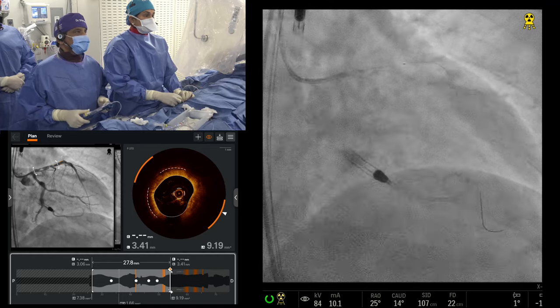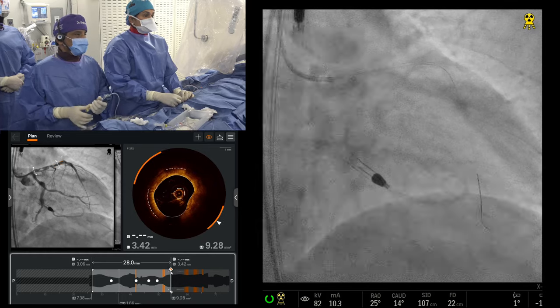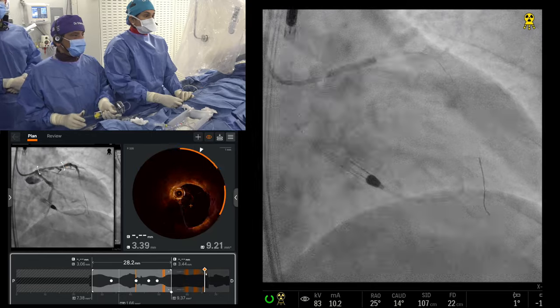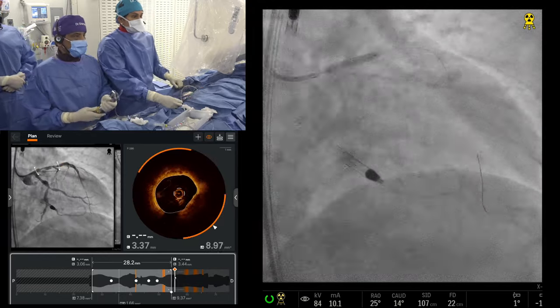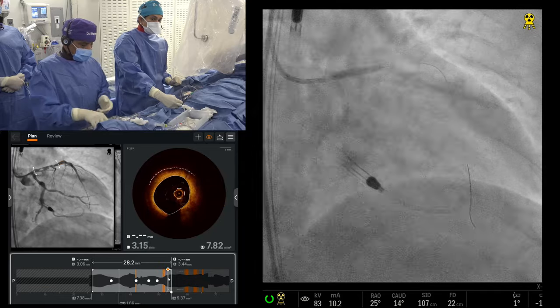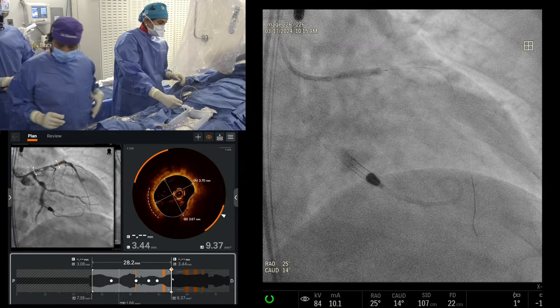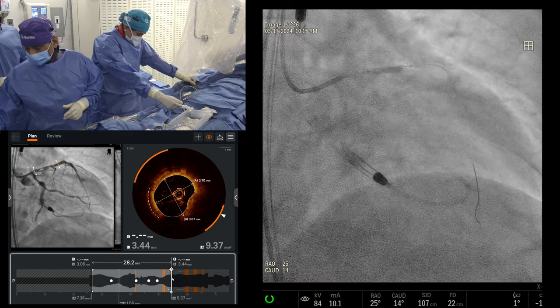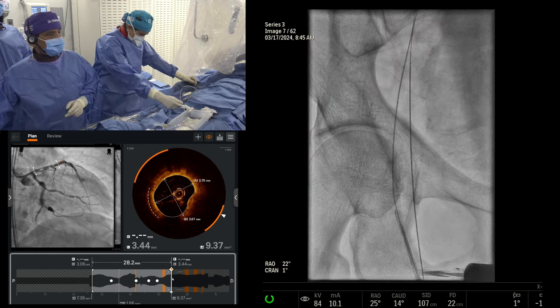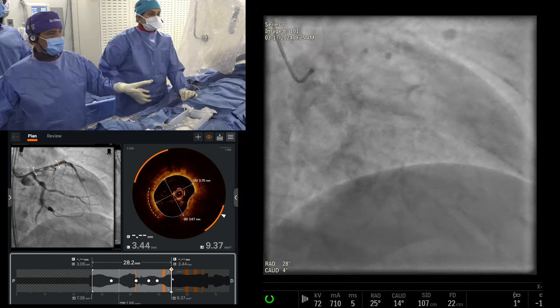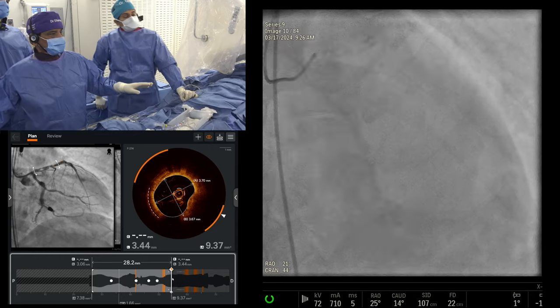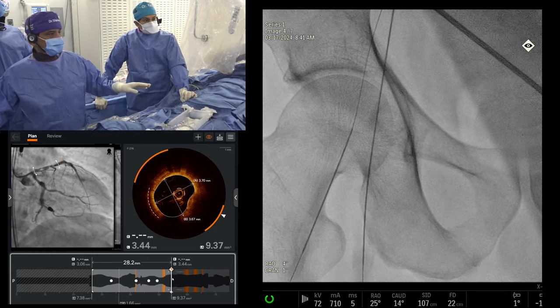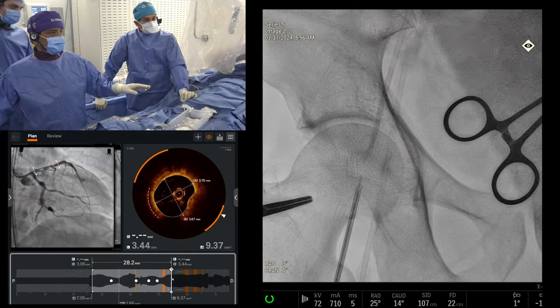Every time we image, it's actionable. On this particular case, we would determine vessel prep, plaque morphology, the distal landing zone, stent placement, and whether the distal vessel size differs from the proximal. Anytime you do imaging upfront — not just to optimize or show apposition — it really helps. It makes the procedure very scripted and reduces operator variability. It's both planning and optimization.